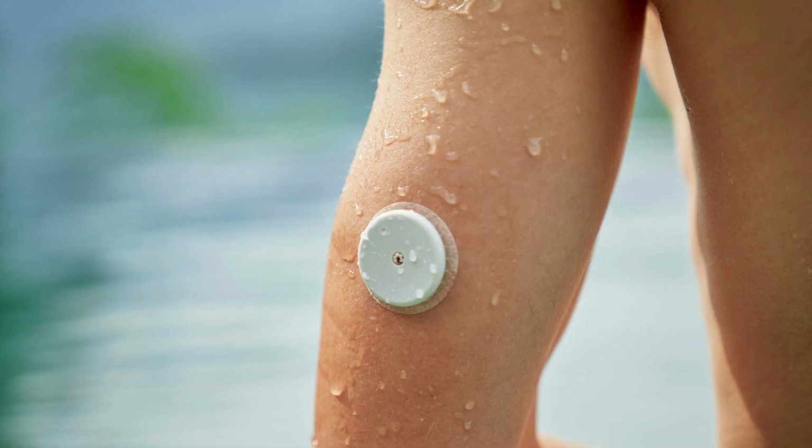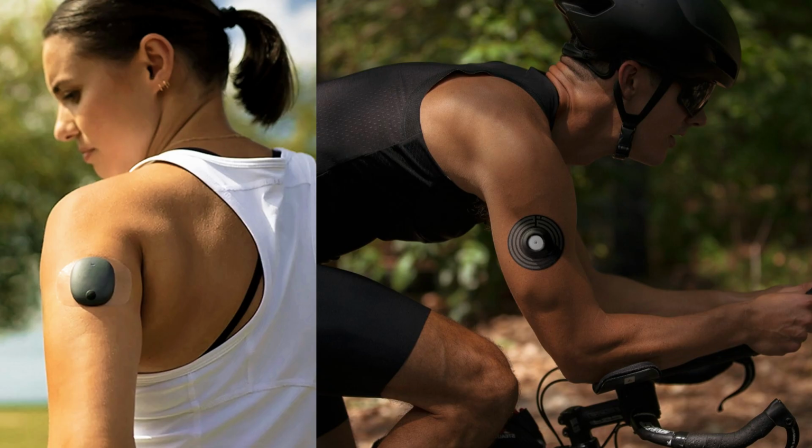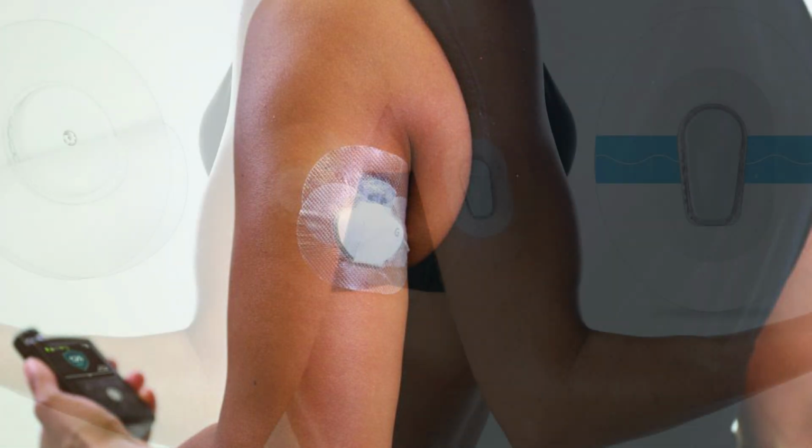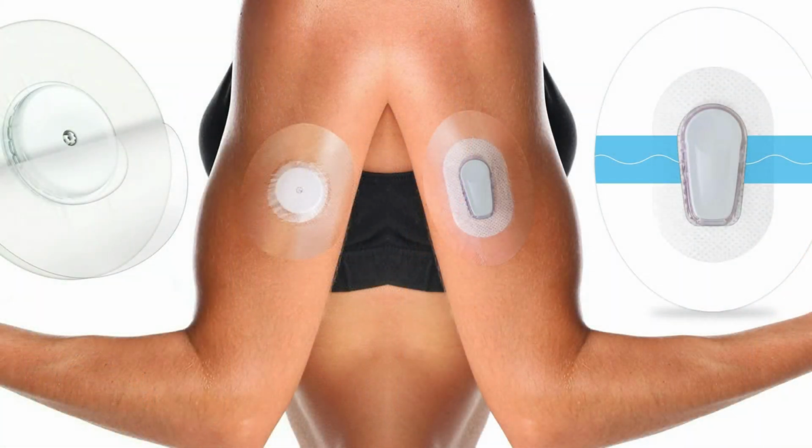and can be worn for any occasion, during shower or playing sports. Note that they cannot be taken off anytime, and if they do fall off, then you have to use a new sensor, so you can apply adhesive tape to prevent that.